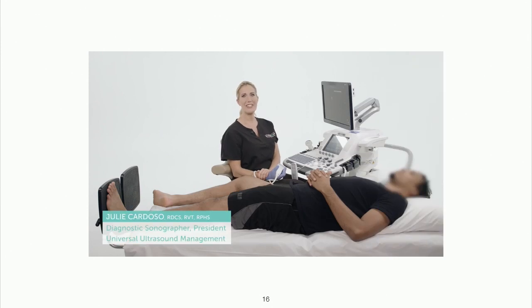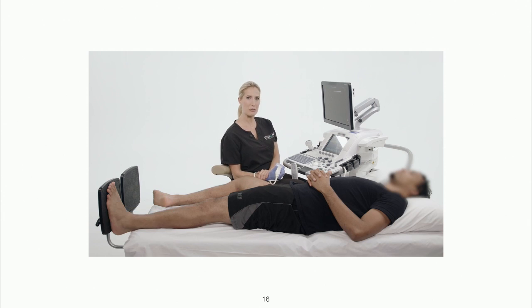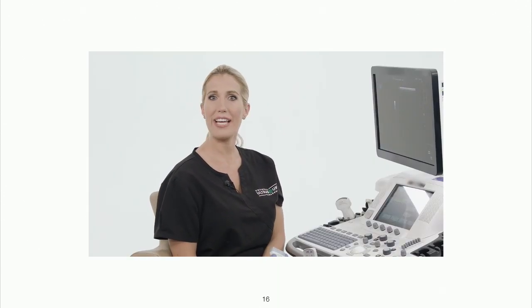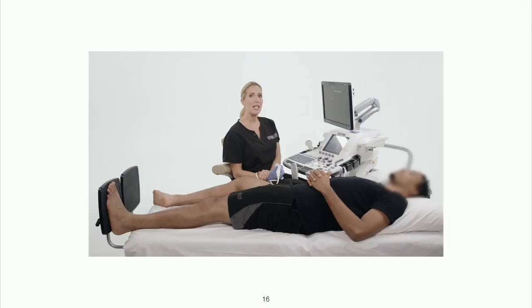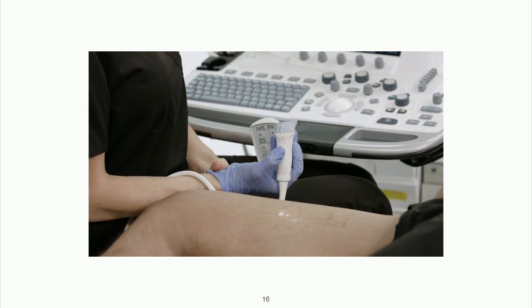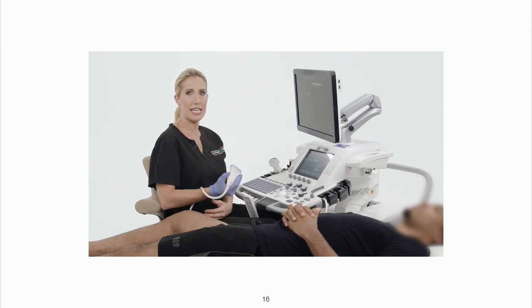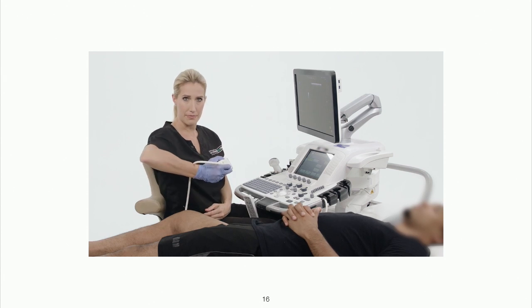Now that we have oriented ourselves, there's one more thing we must consider before manipulating the transducer. Remember that properly setting the ultrasound environment will not guarantee proper ergonomics. The most important thing is for the sonographer to follow proper ergonomic techniques. The position of your arms should be as proximal to your body as possible while being comfortable. Specifically, the abduction of your arm should not exceed 30 degrees.